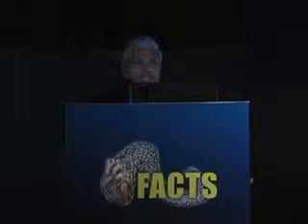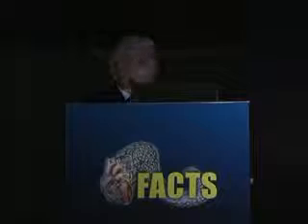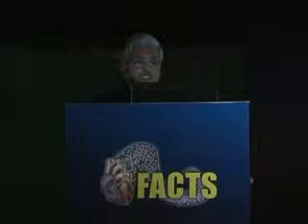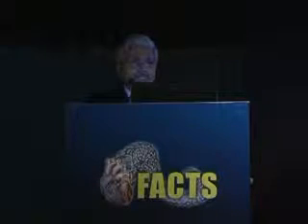Or in this case of a 10-year-old child, a very mischievous fistula. Look at it, it has a very small start. It expands into a huge aneurysmal sac before it opens into the RA, making the navigation through this very difficult. This patient also went for surgical closure from both the sides, the aortic end as well as the RA end.